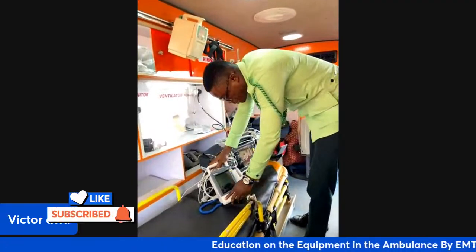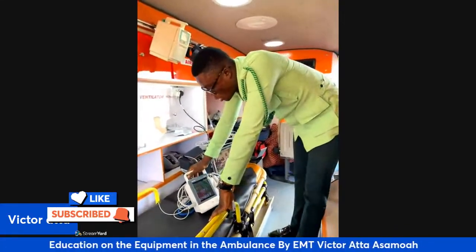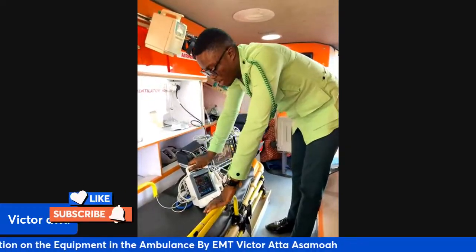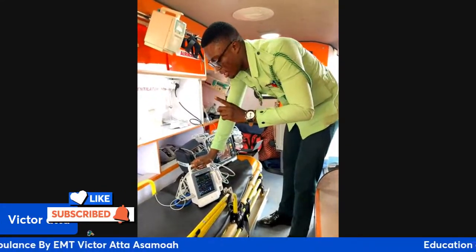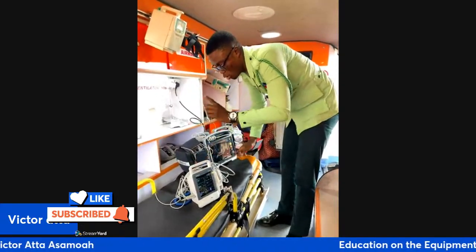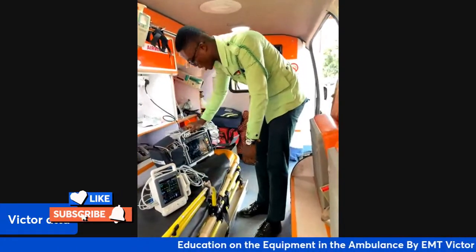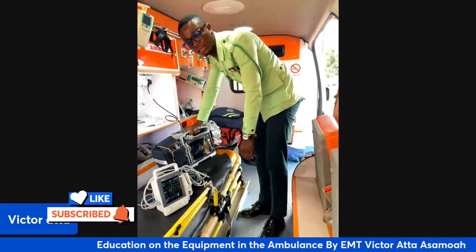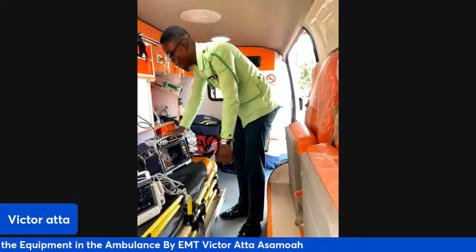This monitor allows you to know some of the vital signs in the patient, but the big monitor allows you to see much more.